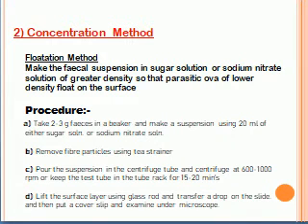The second method is the concentration method. Under this, the most common method is the flotation method. First of all, we have to make the faecal suspension in sugar solution or sodium nitrate solution of greater density, so that parasitic ova of lower density float on the surface.